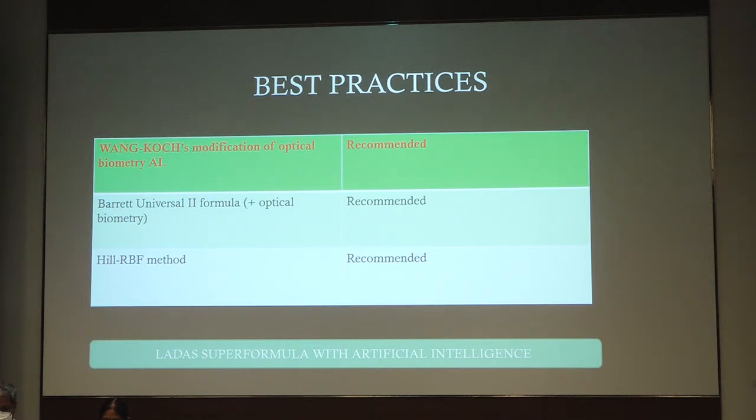Or you can use the Barrett Universal 2 along with your optical biometry, or you can use the Hill RBF formula.